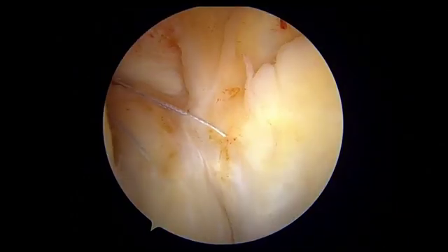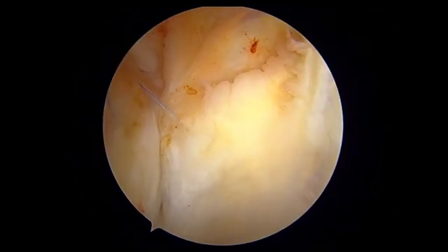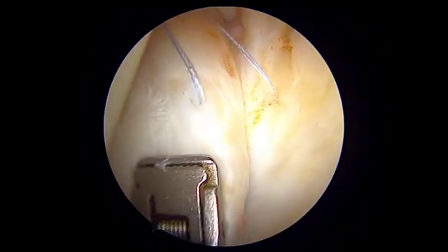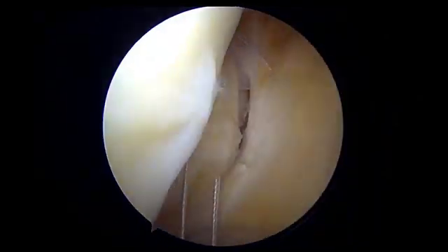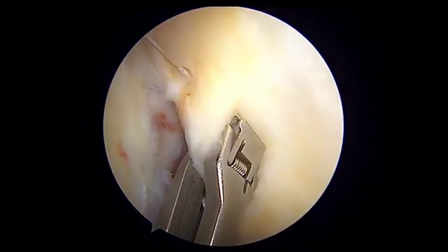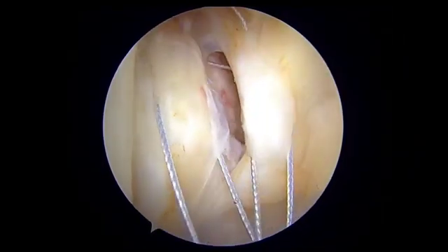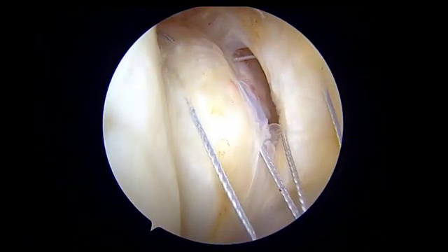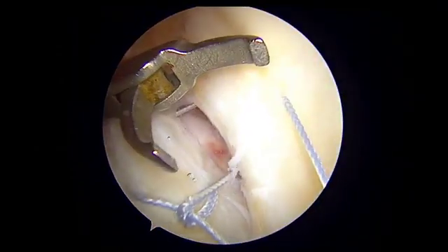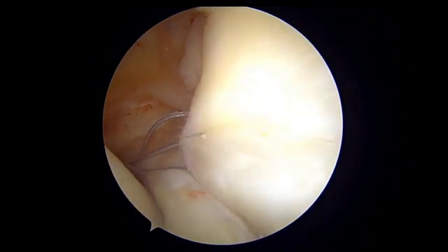At this point we are not going to tie the suture, otherwise it would be difficult to pass the knee scorpion further. The same step is repeated, taking care that the scorpion needle does not hit the articular cartilage. The sutures are passed anteriorly and posteriorly through the capsule. If there is tangling of the suture, it can again be managed. Both sets of sutures are parked using a suture manipulator in the anterolateral portal, and now two sets of sutures are visible parked in the anterolateral portal.